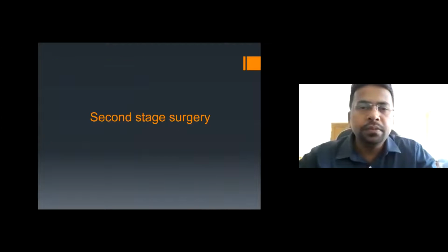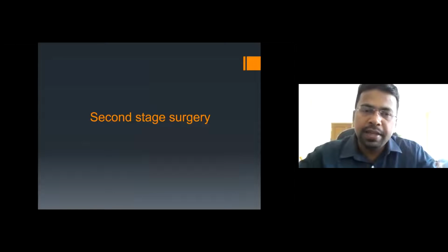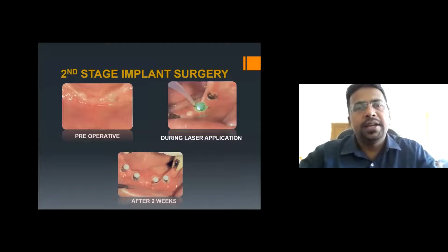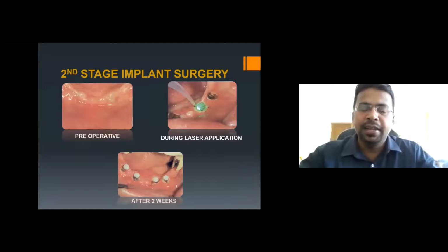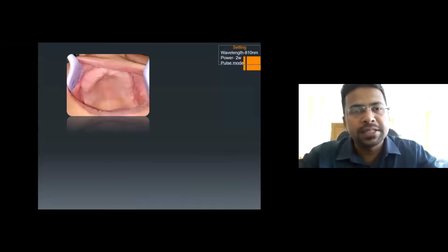So let's see the next case of second stage surgery, which can be performed with the help of lasers. This is a pre-operative photograph and post-operative photograph after using the laser. This is okay for a single or dual implant. But what about multiple implants?